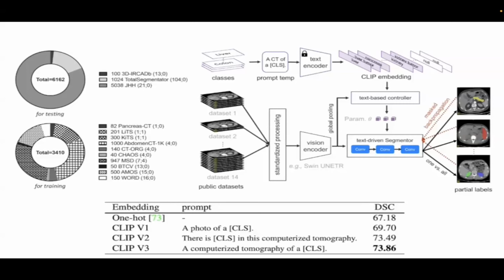Likewise, with the implementation, 5-fold cross-validation is performed. So the best model is going to be selected from each fold. The selection is going to occur based on the metric utilized, so either Dice similarity and/or normalized surface distance.